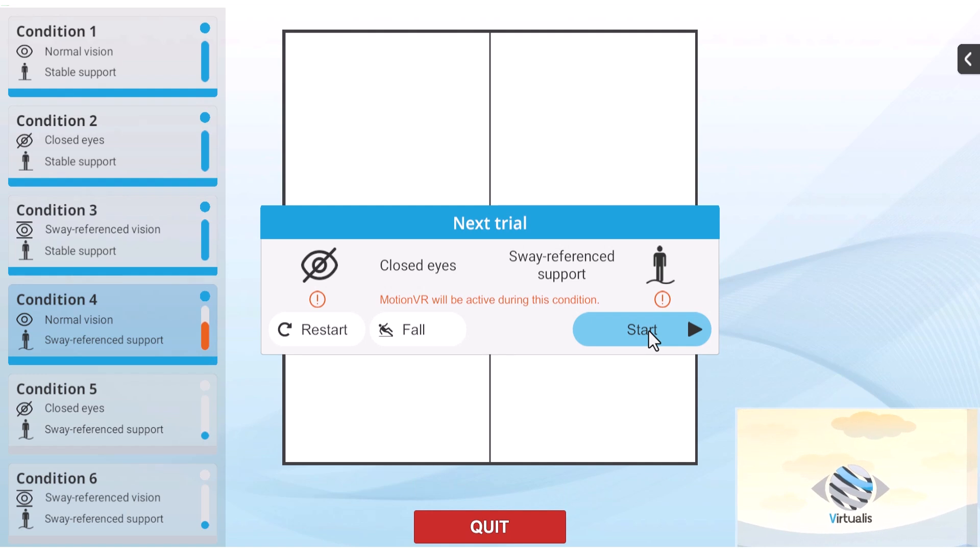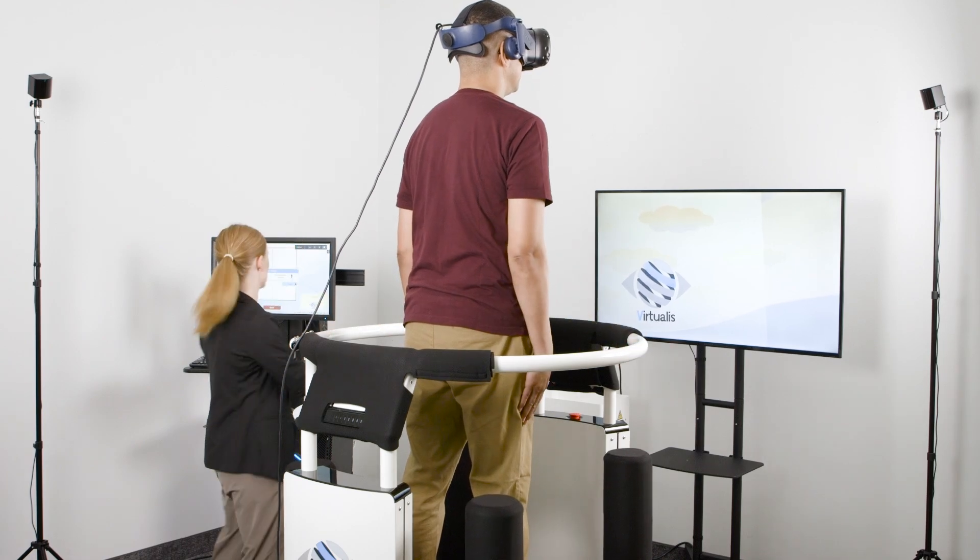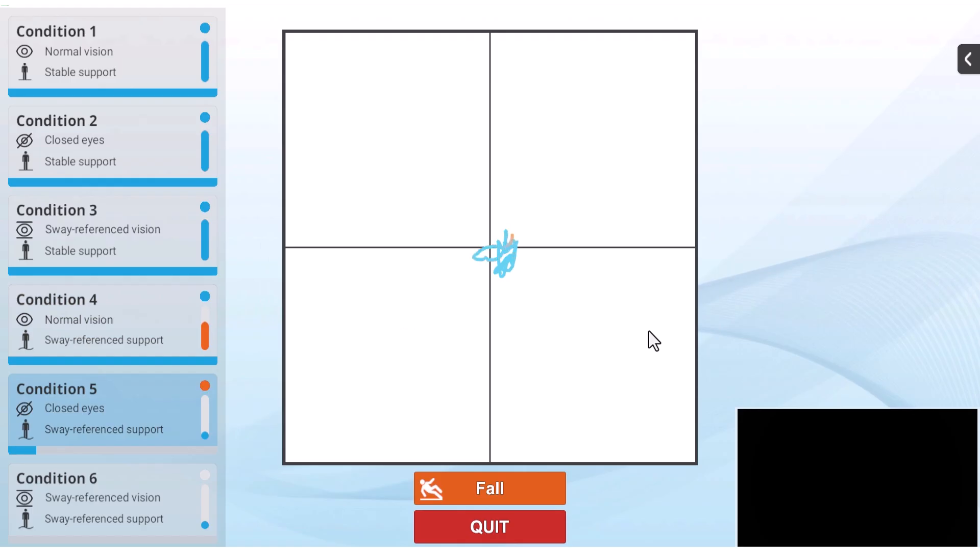After completing condition four, the patient will be instructed to close their eyes before beginning condition five. The image in the headset will turn black to simulate eyes closed.